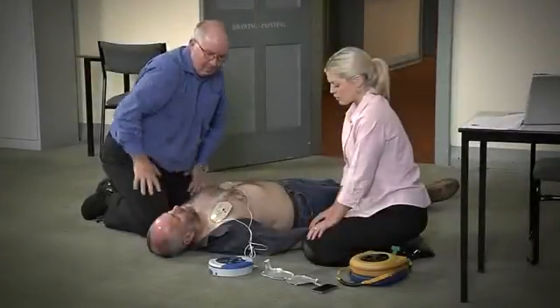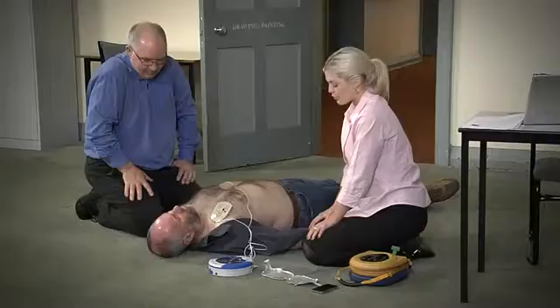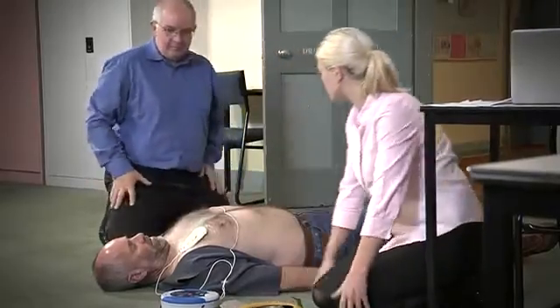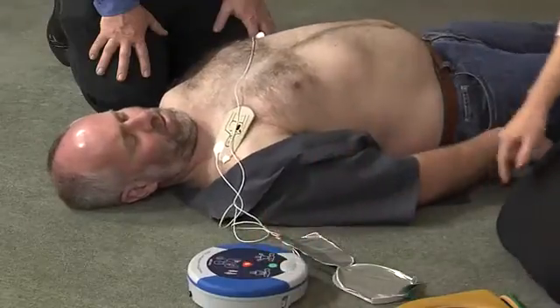Stop CPR. Assessing heart rhythm — do not touch the patient. Analyzing. Stand clear of patient. Shock advised. Press the orange shock button now. Shock delivered.